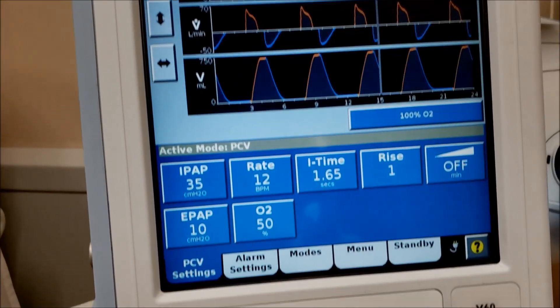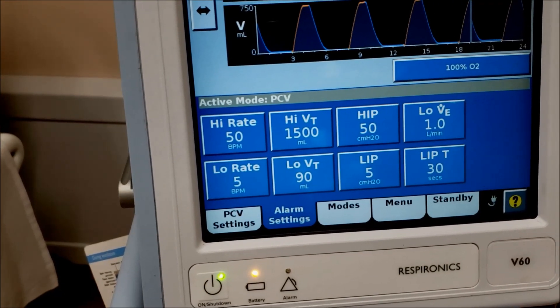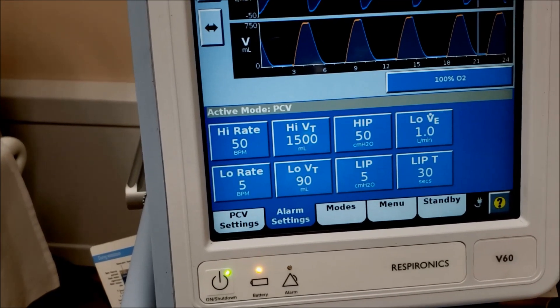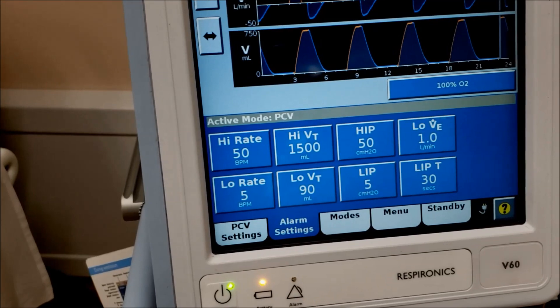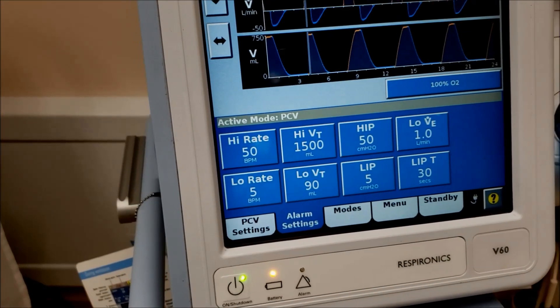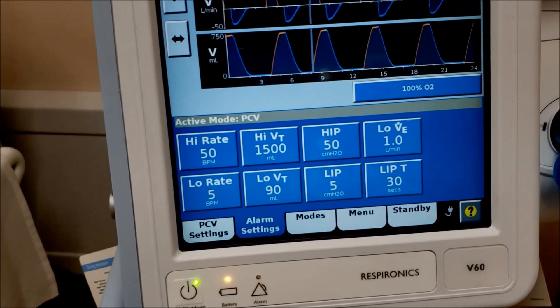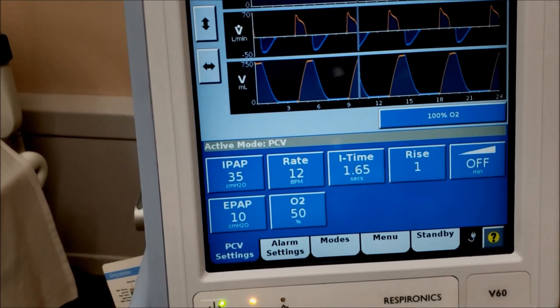We can set alarms just like a standard ventilator: high rate, low rate, high tidal volume, low tidal volume, high inspiratory pressure, low inspiratory pressure, and low minute ventilation — that last one is really important. They come out pretty generic but they work, and you can tighten them up if you want.